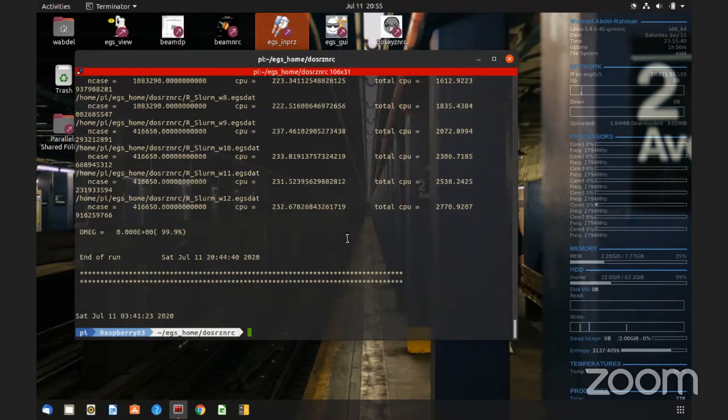Yeah. Okay. So what I would suggest is, I don't know how many particles. Why are you running these long simulations? I really don't understand why. But what you can do, the phase space files are still there. You can add them and combine them. And see, for example, how many particles you have, because you want phase space files, right?